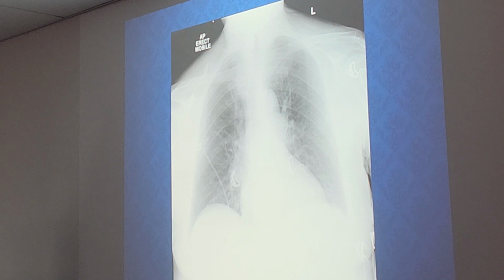The only things that are sending correctly to DICOM are the old Fujifilm CR readers. So if you shoot at an old clinic like Strawberry or Aldine where they have the old Fujifilms, the S values you get are going to be correct. But if you're shooting new stuff at LBJ or Bentaub or on the portables, I do not believe those are the correct numbers going to DICOM.